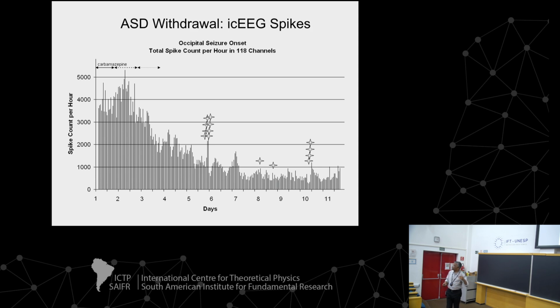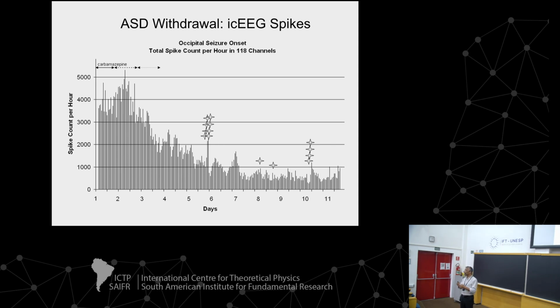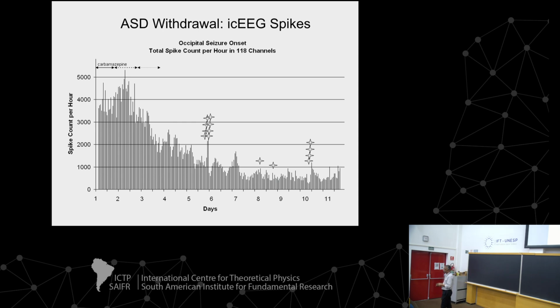Yeah. No, so when you have this number of spikes, it has to be automated, because the experts would refuse to count over 10, 11 days of recording from 100 channels. So we took a standard spike detector that's commercially available, tuned it with our team, and set the parameters according to the expert annotations. We had roughly 80+% sensitivity and specificity within the tests that we did before this analysis. So there are some false detections here, and we've missed detections as well. But given the large numbers represented here, I think this is a correct capture of the overall profile. So it's the absolute opposite of what we expected.